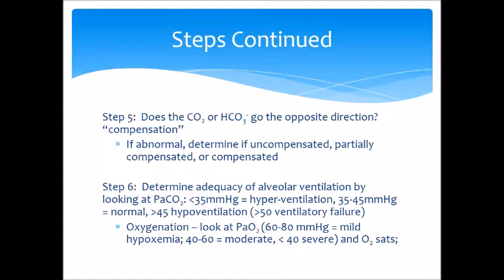If we're in a respiratory condition, are the kidneys compensating through bicarbonate? Or if we're in a metabolic condition, do the lungs compensate through carbon dioxide? Our last step is to determine if we're in a hypoxic condition by looking at our oxygenation.